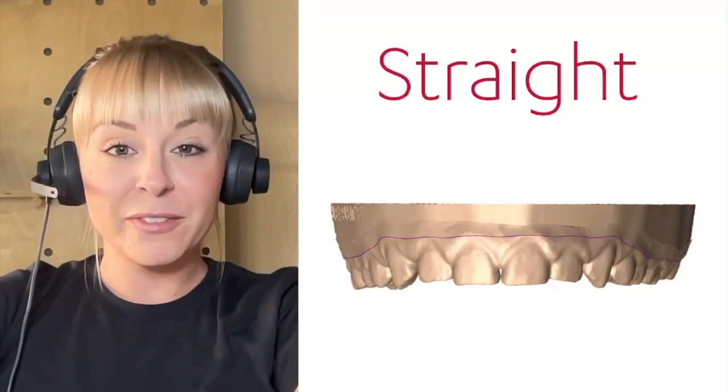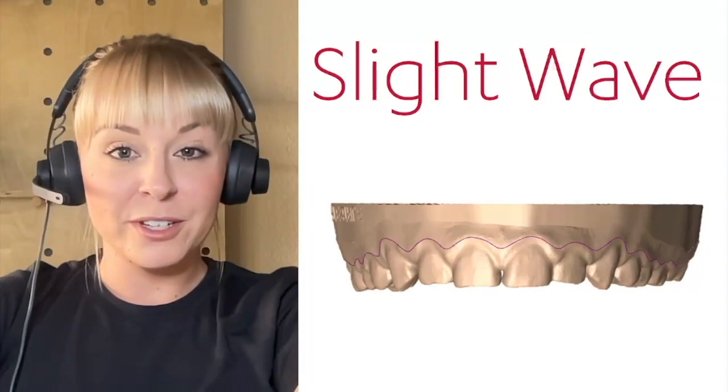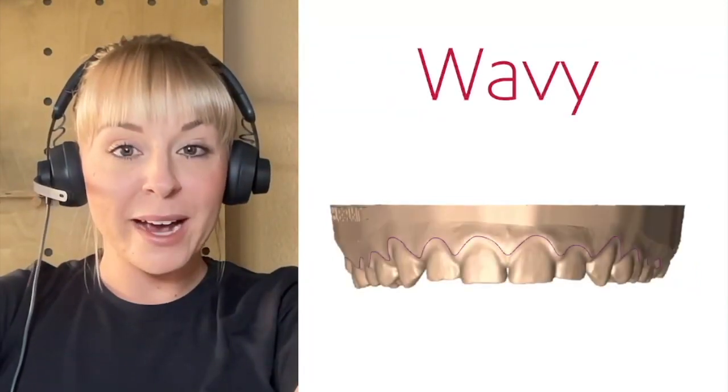There are several options available for trim line styles. You can choose a straight line, have a slight wave to the line, or have a maximum wave.